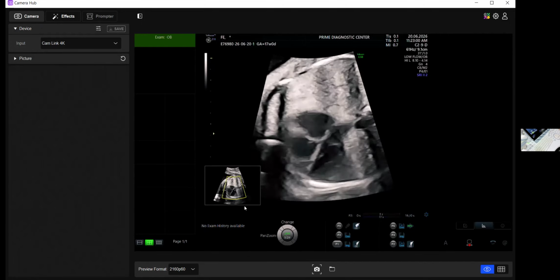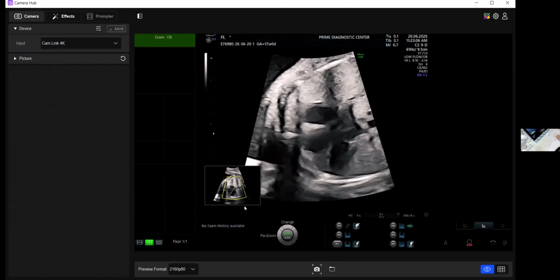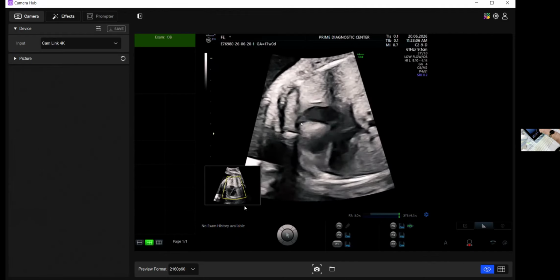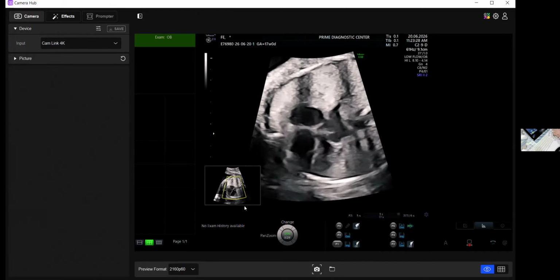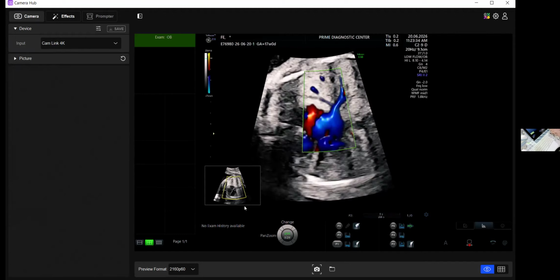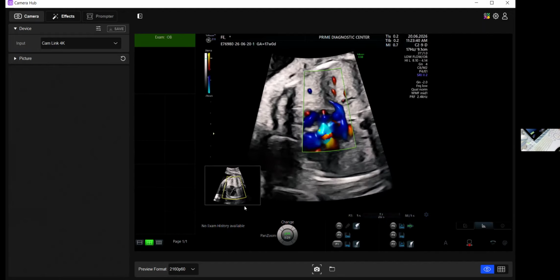And whoever is interested in the right atrial appendage can see the appendage on this side. It looks like an outpouching, you can see this is an appendage, and these are the pectinate muscles we see in the right atrial appendage. Okay, I'll run this cine again, and you see this is the right atrial appendage. We'll attempt the left atrial appendage somewhere there. You see the pulmonary vein, and that's fine. Very nice flow in the pulmonary vein, not an issue at all. Okay, you see the left upper pulmonary vein and the right upper pulmonary vein.